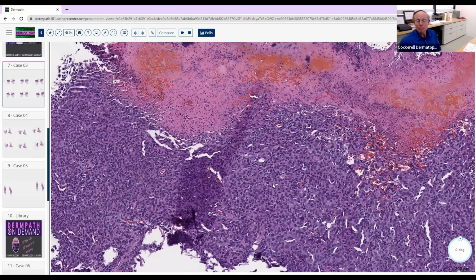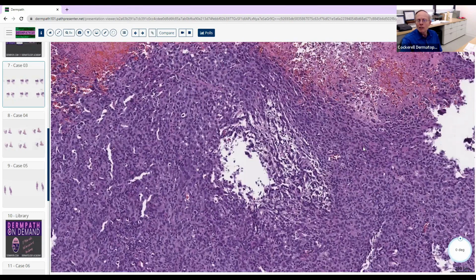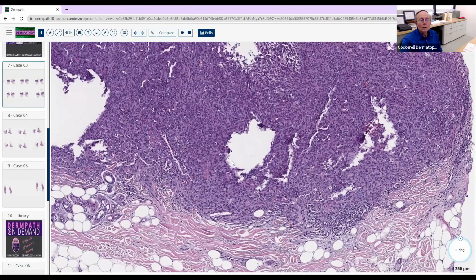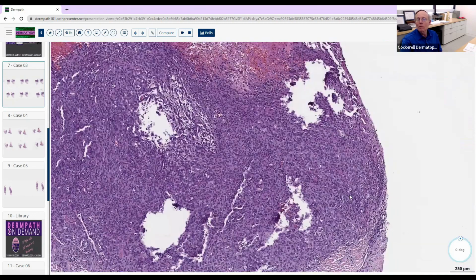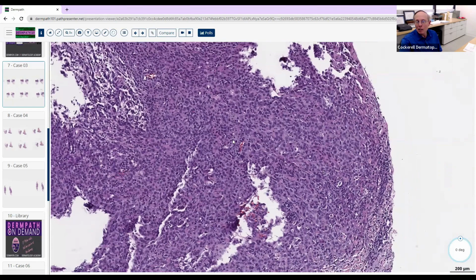It really almost looks like either a granulomatous process, like you said, or maybe even a melanocytic lesion that can look epithelioid, or it can look like a squamous cell carcinoma in some cases, a poorly differentiated squamous cell carcinoma. So this is a lesion that's almost a wolf in sheep's clothing a little bit, because it doesn't look exactly like an angiosarcoma, but this is probably one of the most aggressive tumors that we have in dermatology.